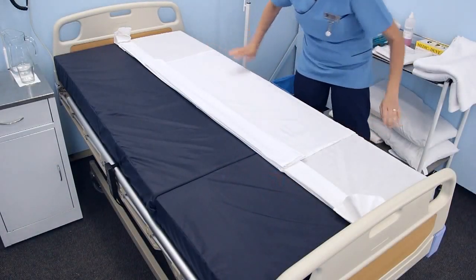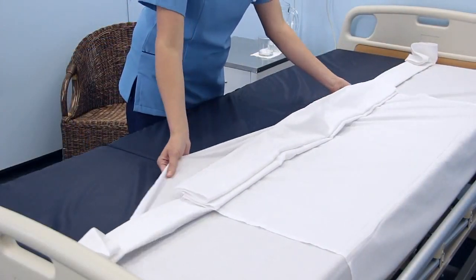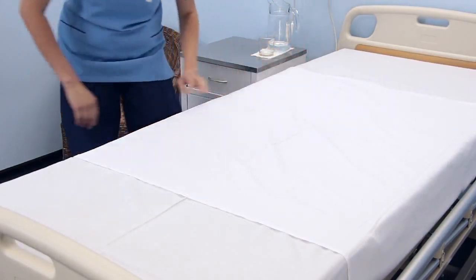Continue to the other side of the bed. Open the fan-folded linen and straighten them. Follow the previous steps for folding and tucking the bottom sheet and drawer sheet.